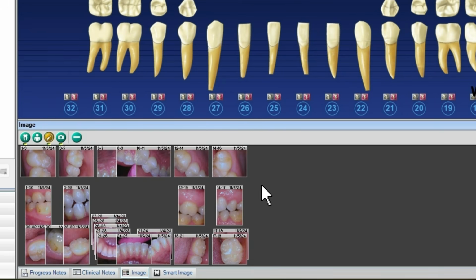So I would highly recommend, if you don't have an intraoral camera, I use the MouthWatch camera. I love it. It's very basic, easy to use, and affordable. I use their basic model. It's $299. They also have a MouthWatch Plus HD camera now that's $999. Both amazing, but really if you're looking for something just easy to use and affordable, the $299 one is amazing. We have one in every operatory in our office, which saves so much time. If you're going to use cameras, I would get one in every room, put it there when you need it.